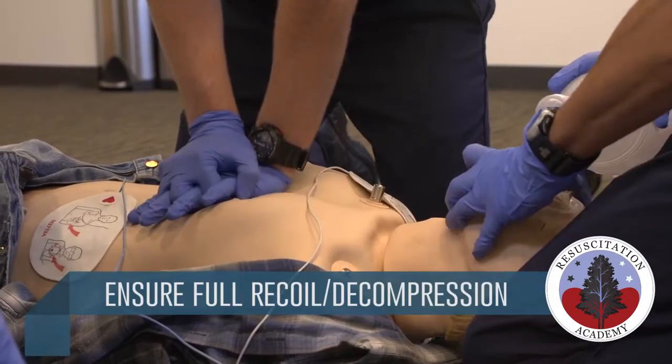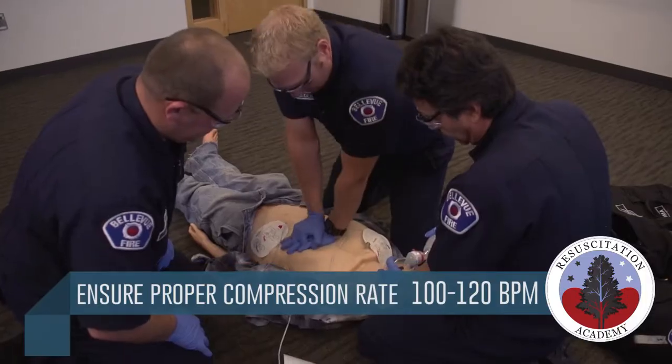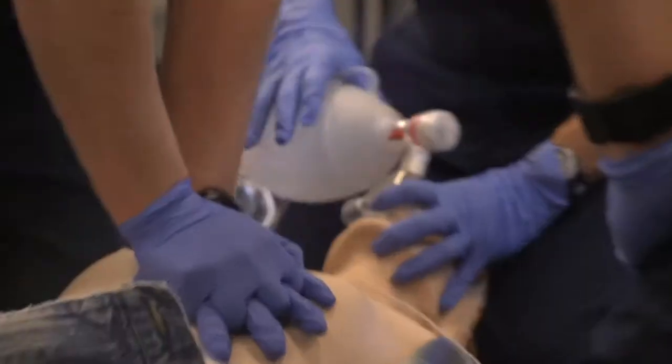We've got about a minute and a half of CPR left to go. Count it out for me now. 28, 29, 30. Apply pads.